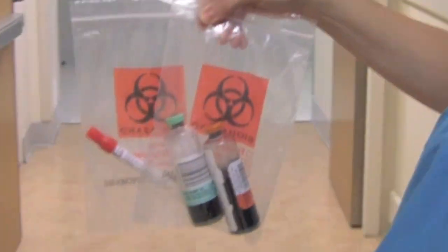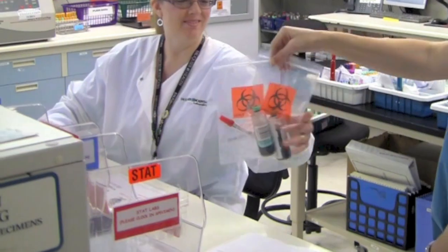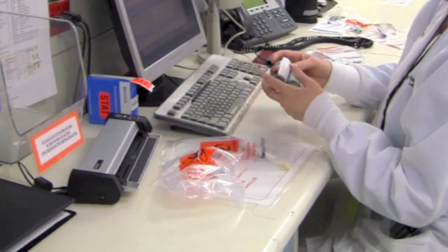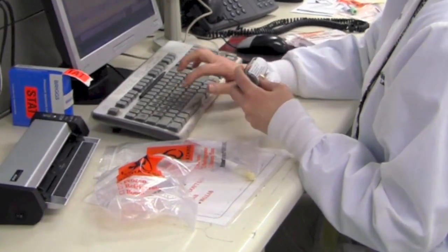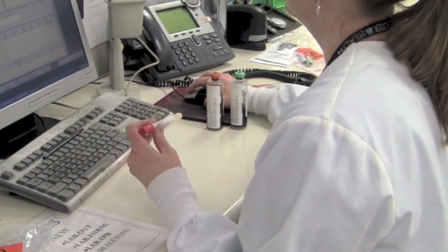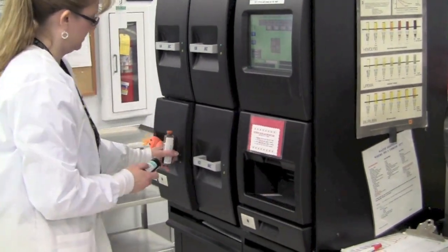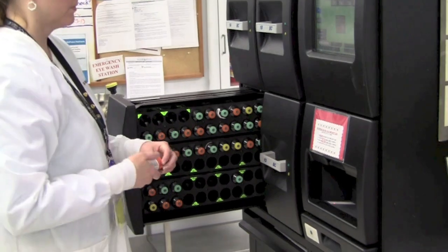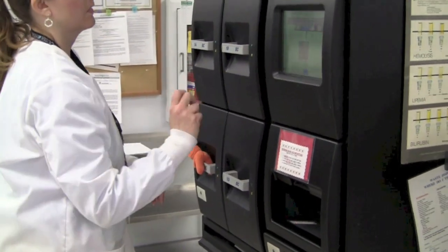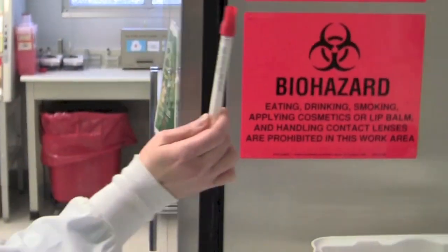Both these culture samples are delivered to the microbiology lab where a technician logs the samples into a computer. The blood cultures are placed inside an incubator to allow any infection present to grow further before processing. The ear culture is placed in a holding bucket along with other samples that have been collected from other patients.